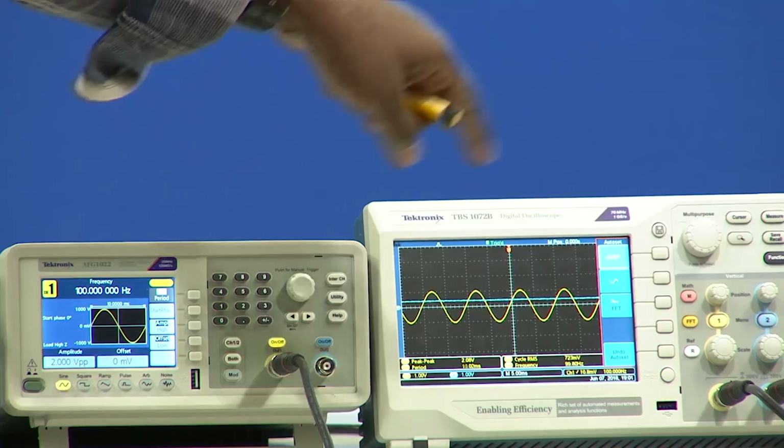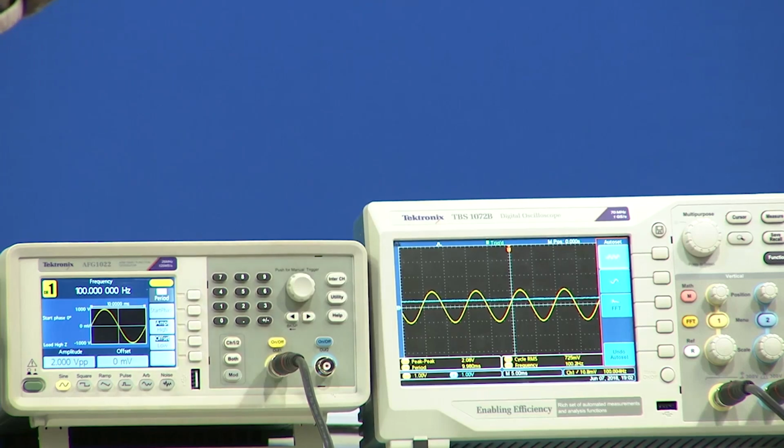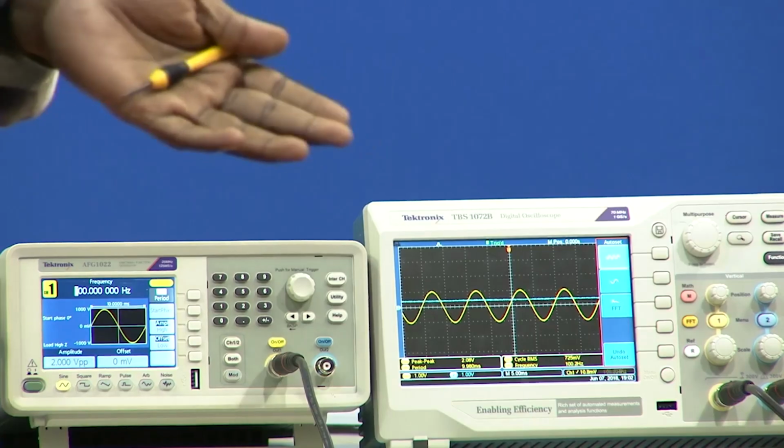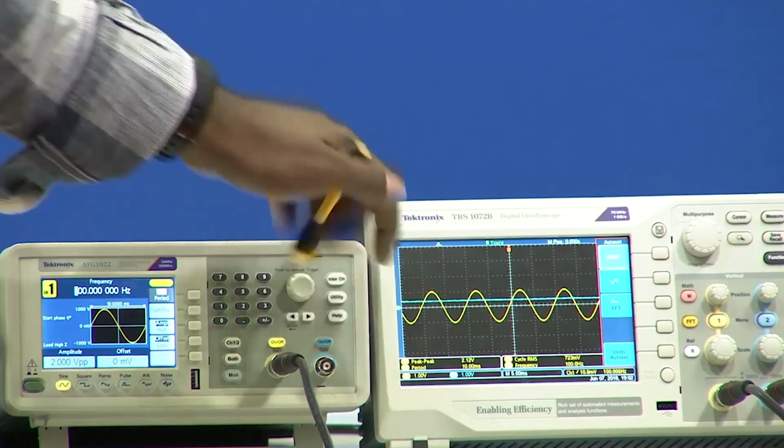The peak value is 1 volt, 1 box, and the blue color, if I see, is 2 points. So somewhere around 486 millivolts we are getting. The reason why there is a difference between the calculated value and the experimental value may be because of some loading due to the previous stages, or because of the tolerances. Since we have used 1 mega and 2 mega resistances, the 5% tolerance is enough to change the complete resistance value to other values. So because of that tolerance and some previous loading stages, it is going to show some other threshold value.